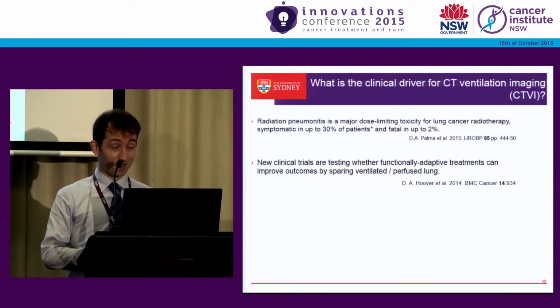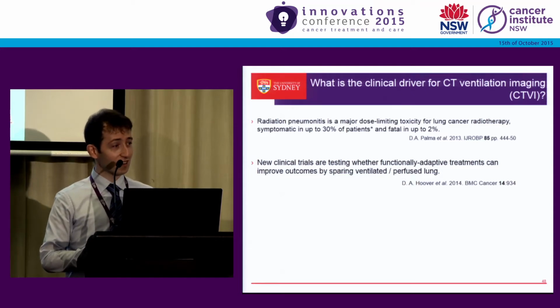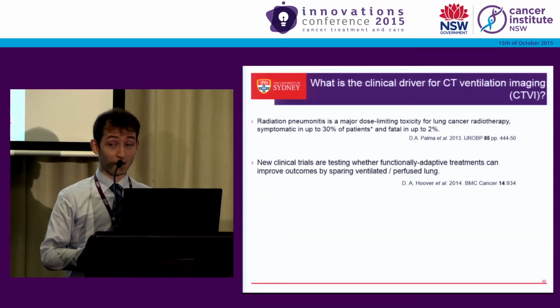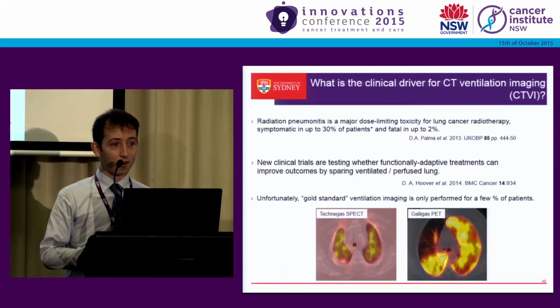So it's anticipated that this could improve the functional dose volume metrics by 5 gray or more, which translates to a few percent of patients that may avoid severe toxicity outcomes as a result of lung cancer radiotherapy treatment. So it's a very important goal. It's something we're all really excited about.